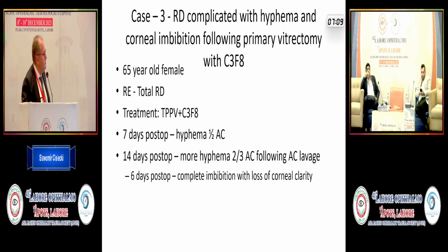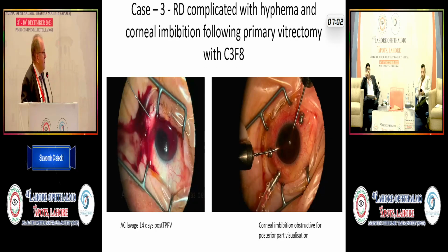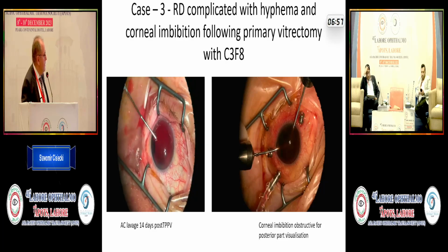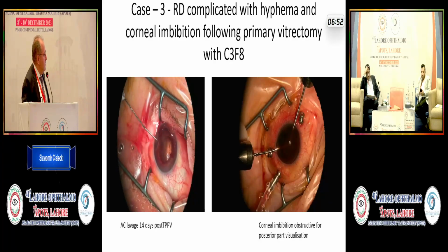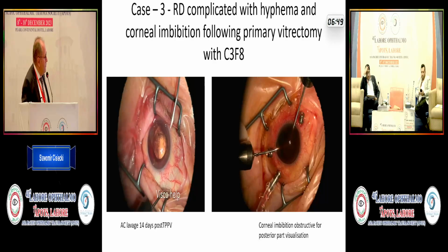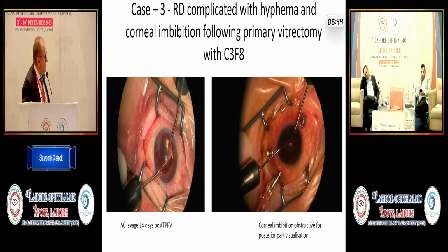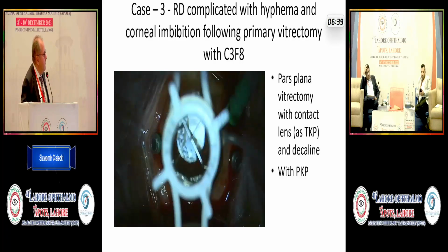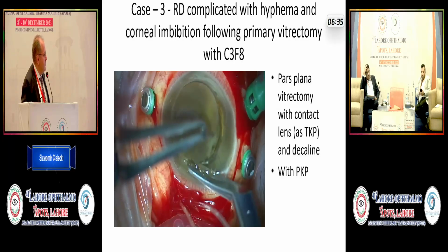The surgery was made elsewhere, not in our hospital, and there was massive hemorrhage. Our colleagues tried to remove the blood from the anterior chamber, but unfortunately it didn't work, so the patient was referred to us. We did corneal transplantation. You can see the imbibition of the cornea.